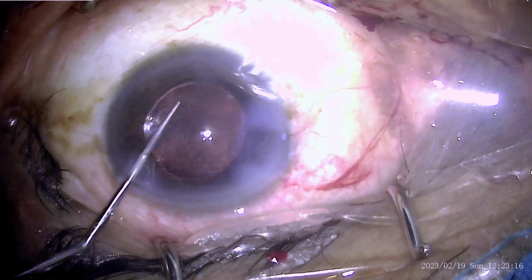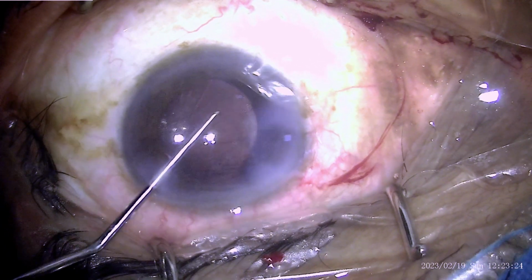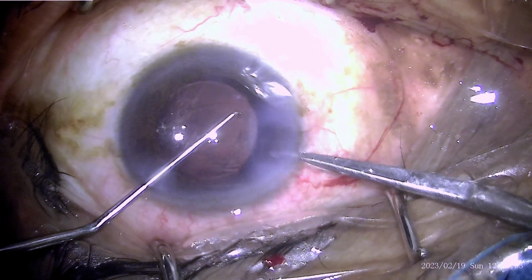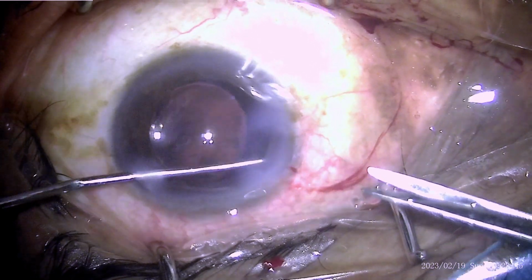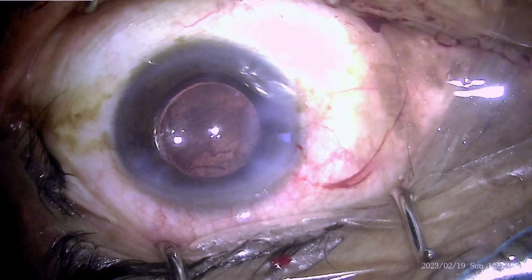Now once these things are completed, then one can simply again reassure that there is no vitreous. In case there is a vitreous strand in the wound, one can use a dialer to sweep, and one has to cut so that it doesn't push the IOL away, and more so it is not there in the wound, so that there are no compromises in the long term.